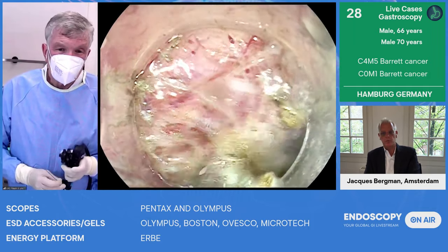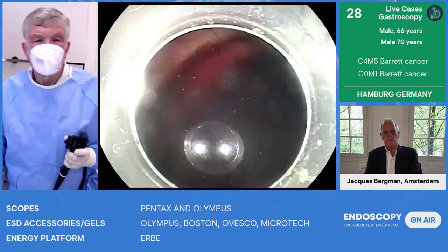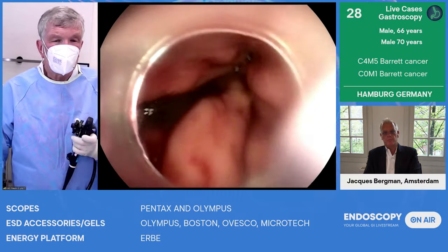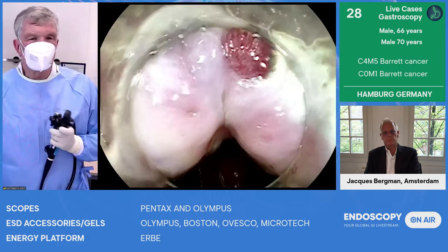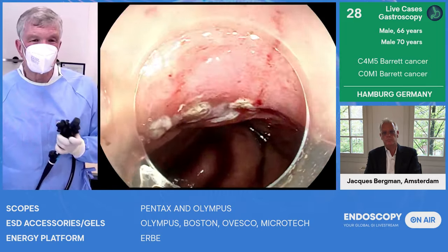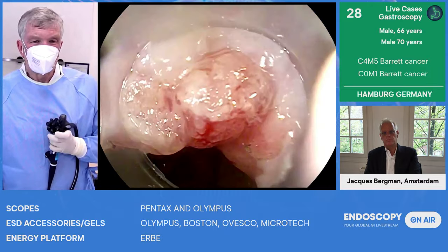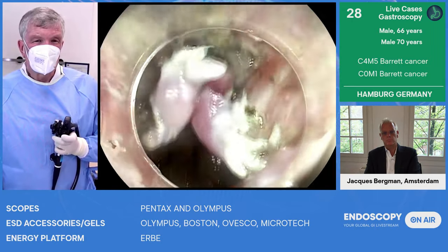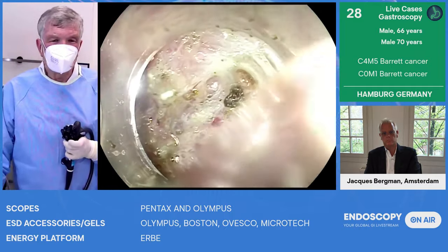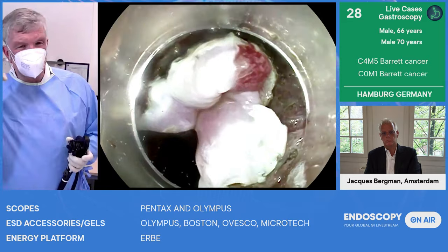So Thomas, are there any basic rules when it comes to the incision? You say I've circumcised the lesion. What's the most common mistake that people make when they circumcise the lesion? Well, there are different strategies. If you talk to Japanese, they have several different strategies how to access these lesions. So usually I finish the circumcision, which I will do probably when we have left you. And then in larger lesions, I do a tunnel. So I go through here and then I leave the sides on both sides for the tunnel. Quite often I place a clip and pull on the clip.